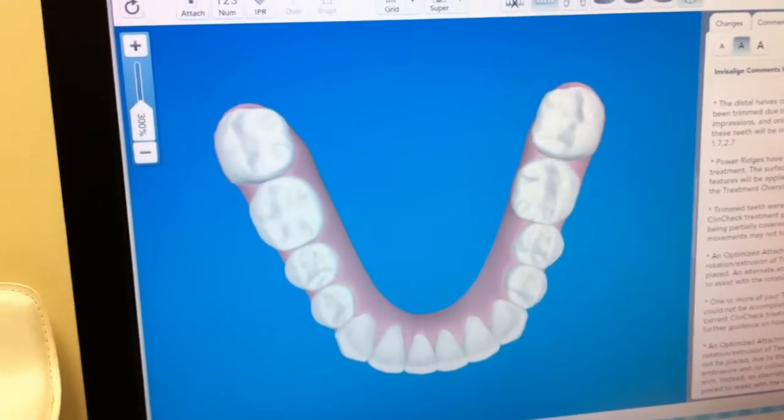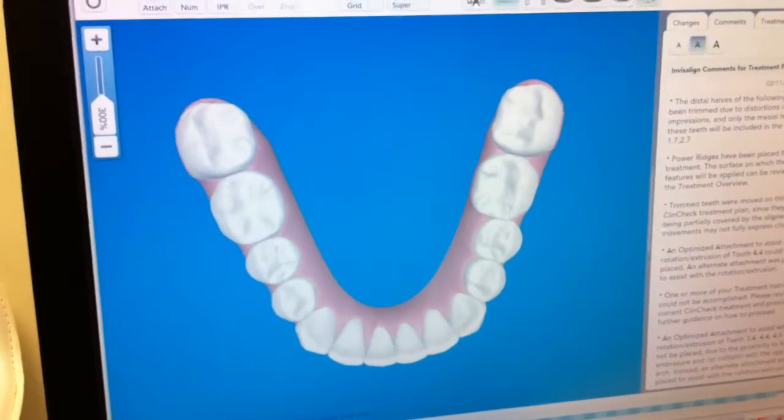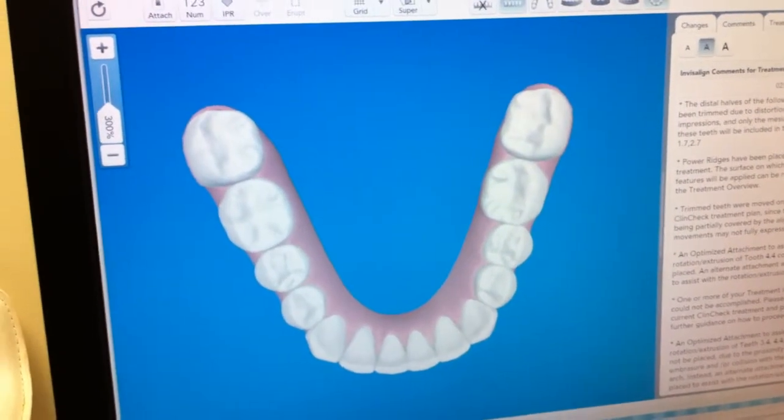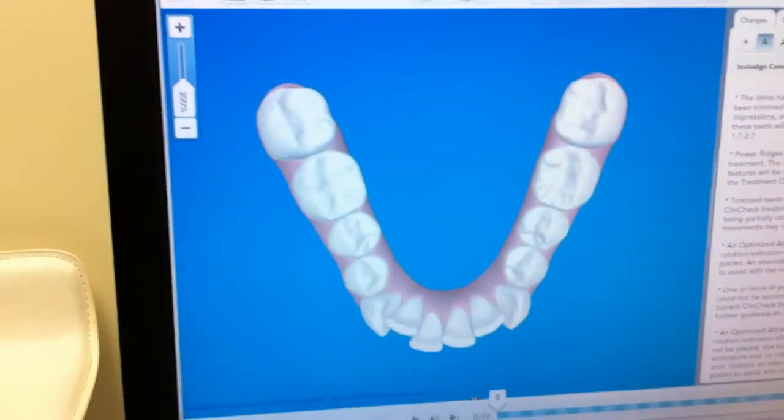As you can see, there's a number 32 here — it means that there will be 32 liners involved. So every time I move this button, it shows you what stage the teeth should be at. That's how we follow it.